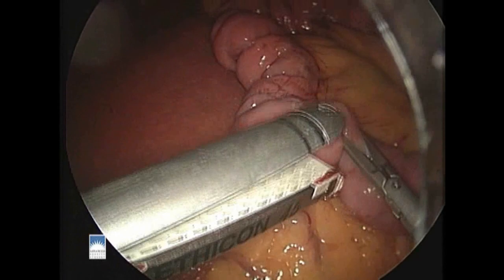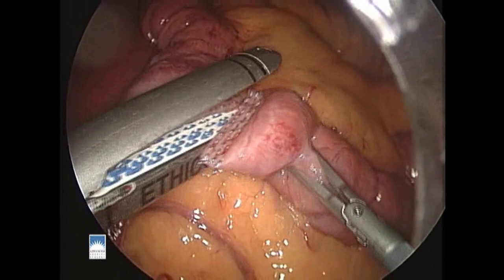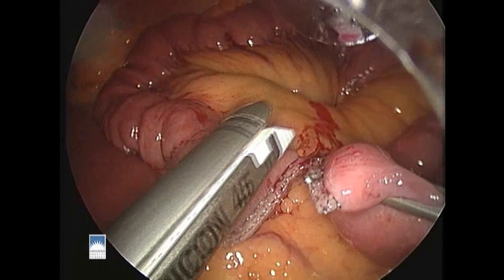We start at the ligament of Treitz and measure back to a comfortable distance from there. We then divide the bowel here with a white cartridge stapler. The stapler lays down triple rows of titanium staples on each side and cuts in between automatically. We'll immediately place a clip on the distal stump of where we've divided the bowel so we can keep track of which is which.